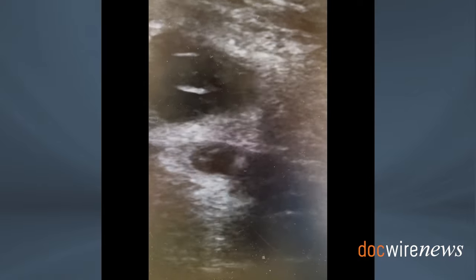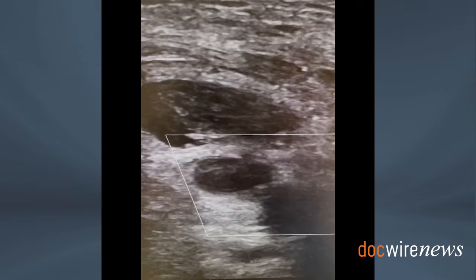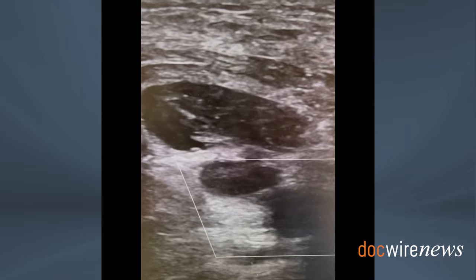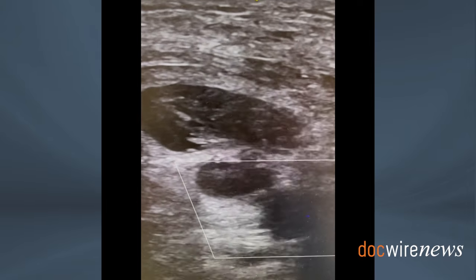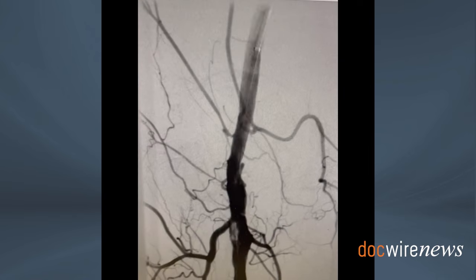In order to know exactly where it is, fluoroscopic guidance with a hemostat was very helpful to guide us to where the needle should go by ultrasound. The fluoroscopic-ultrasound coordination is very important. As you see here, the needle tip is exactly where we needed it to be, making sure we are not injecting into the artery.